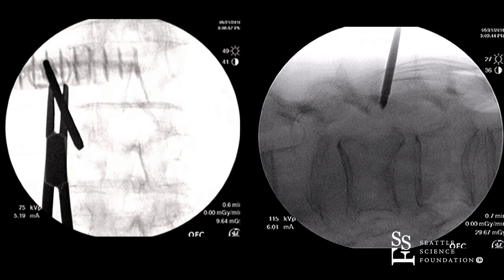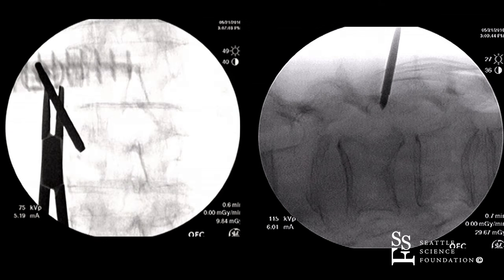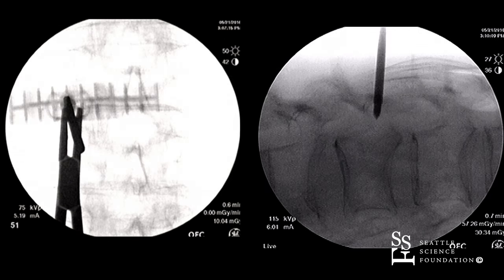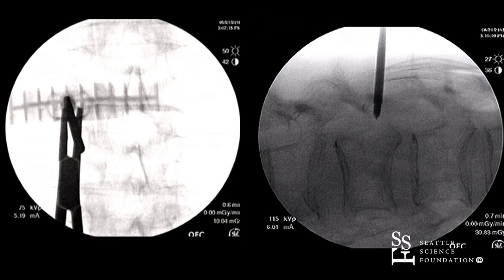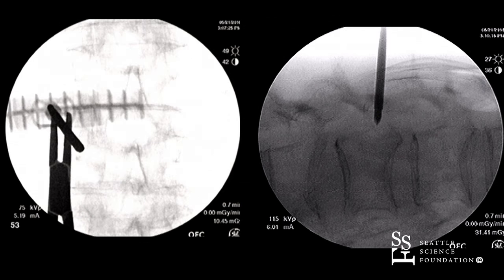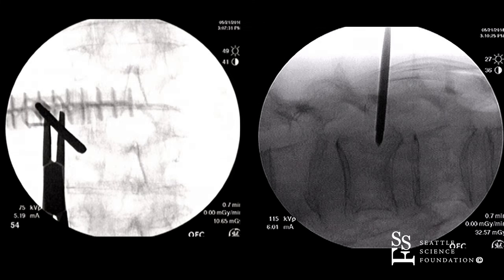Now we're well away from the medial wall of the pedicle. You have to be careful, making sure you're staying away from that medial portion. And now we've just entered — you're still nicely away, or just touching, the medial cortex of the pedicle there.